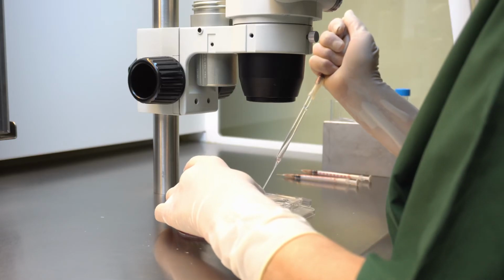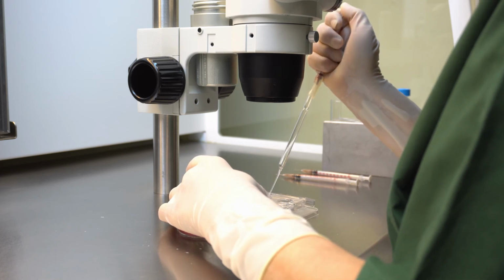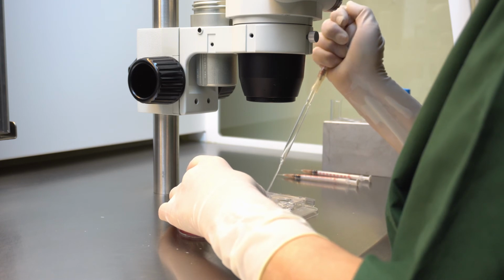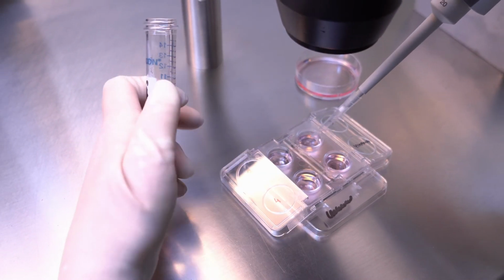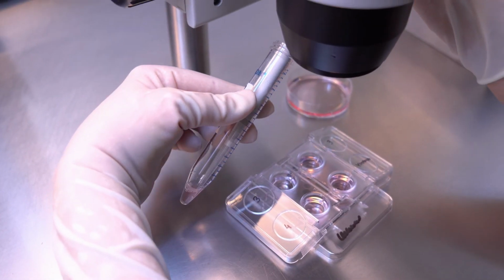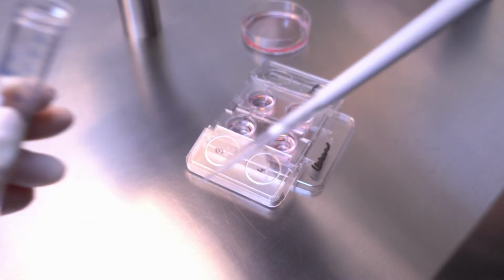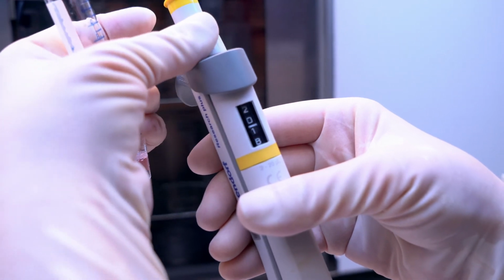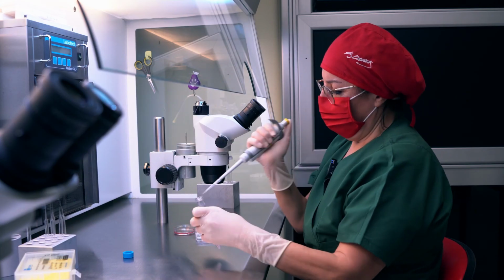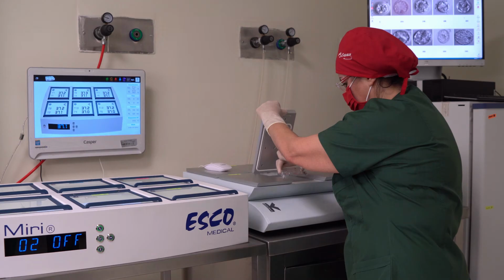The volume of sperm suspension to be used for insemination is determined, given that 100,000 sperm cells will be used per cumulus oocyte complex. Since the first 2 wells contain 3 cumulus oocyte complexes each, 15 microliters of sperm suspension will be added to the first 2 wells, while 20 microliters of sperm suspension will be added to the third well. Using a manually adjustable pipette, the required amount of sperm suspension for insemination is released onto the oocytes and placed in an incubator.